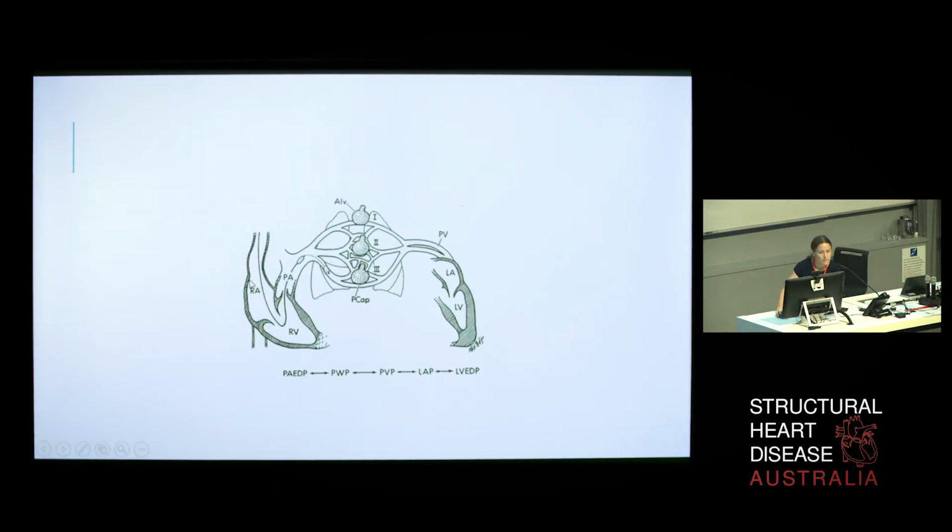So what I do, and we'll see this very briefly later, is place the catheter through the right atrium and the right ventricle up into the PA and then down and wedge it gently. So we have the balloon up, we flow with the blood nice and slowly down into a wedge position. And the reason we can then wedge and get left-sided pressure is that this balloon is occluding the blood behind it essentially. So the transducer is in the tip of the line there, and it's in a column of blood all the way through the lungs onto the veins here, similar size vein, and that's where we're getting a pressure because that's in a column of blood, ideally into a left atrium that's not obstructed.